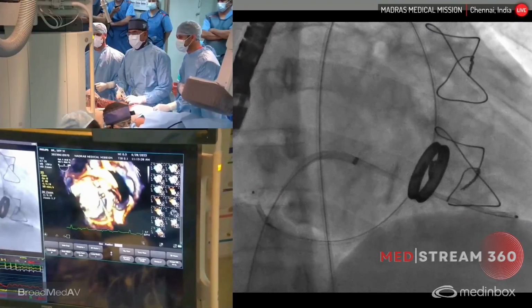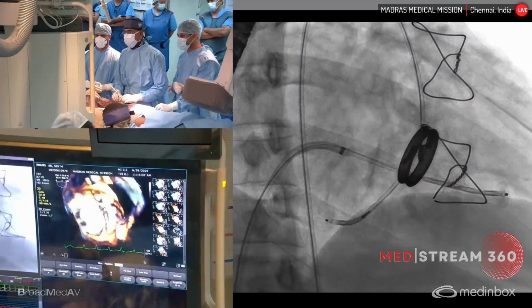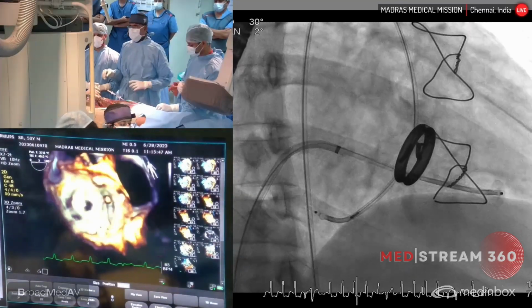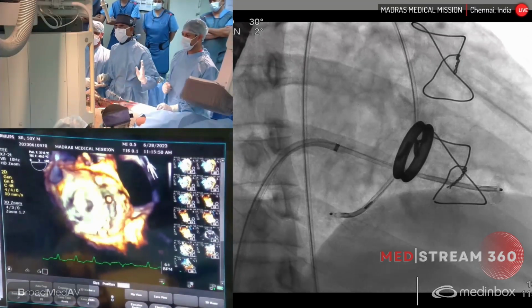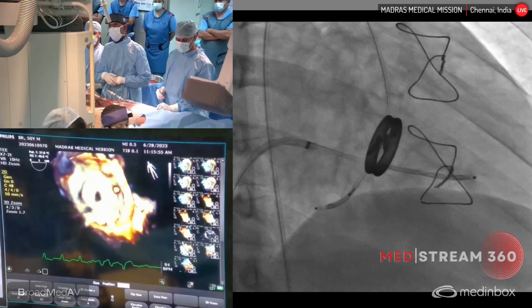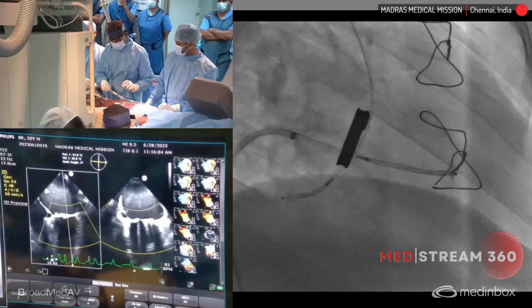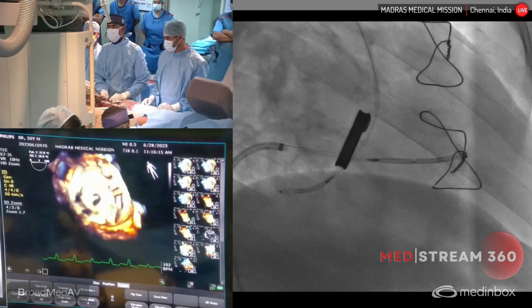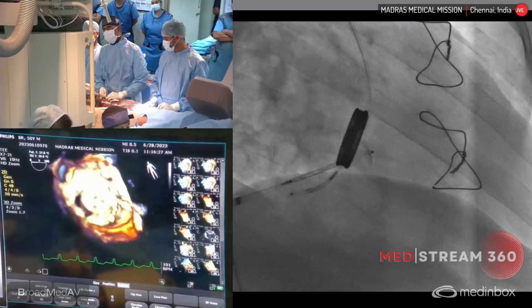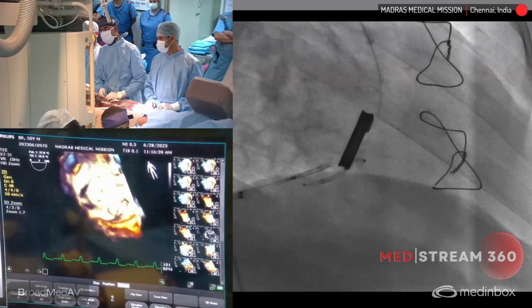I'm trying to get it up. What I'm planning to do is get one of the plugs come closer to the mitral valve. Now I have two plugs, one from this side and one from that. We'll target the larger plug. I want the disc to be exactly in profile. Give a cranial or a caudal on this, make it like a flat disc, absolutely in profile. Perfect view. I'm advancing the middle belly. I'm withdrawing. I'm trying to position the middle belly across the leak. At this position, I'm slowly peeling back.